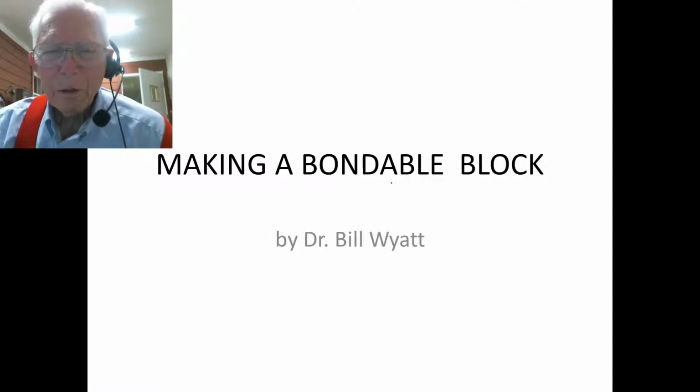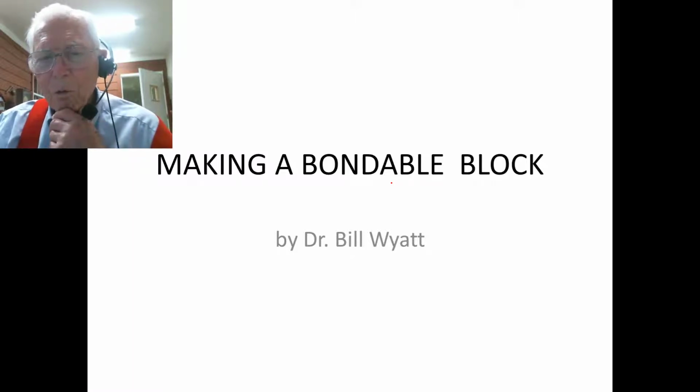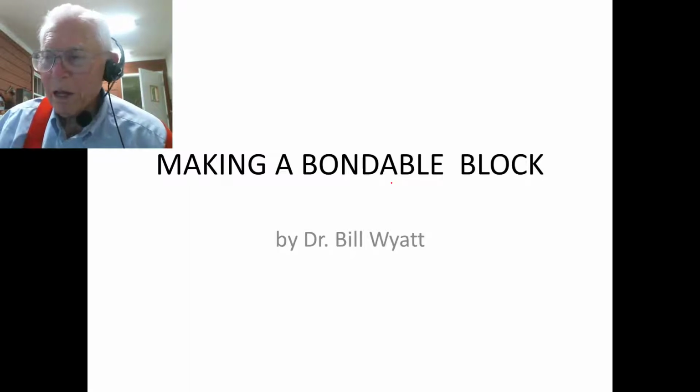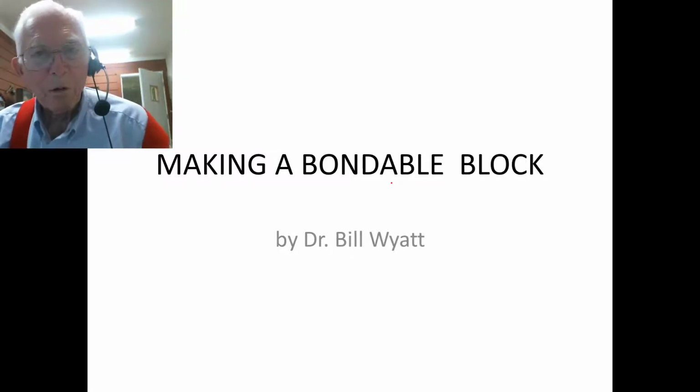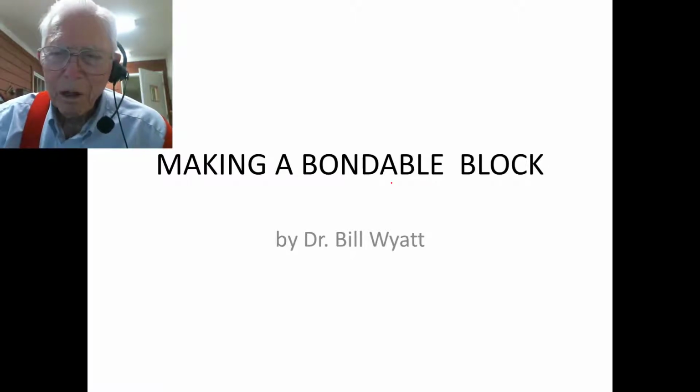I'm going to talk to you about making these bondable blocks. I've been showing you how we use them so much, so I thought I'd better show you how we actually make the block. It's not difficult, and this is an old way, and you may have newer, better things now, but we started making them years ago out of just plain lab acrylic, and that worked fine. And we would bond that to the teeth, and it didn't bond all that tight. And when you get ready to take it off, let me show you how.